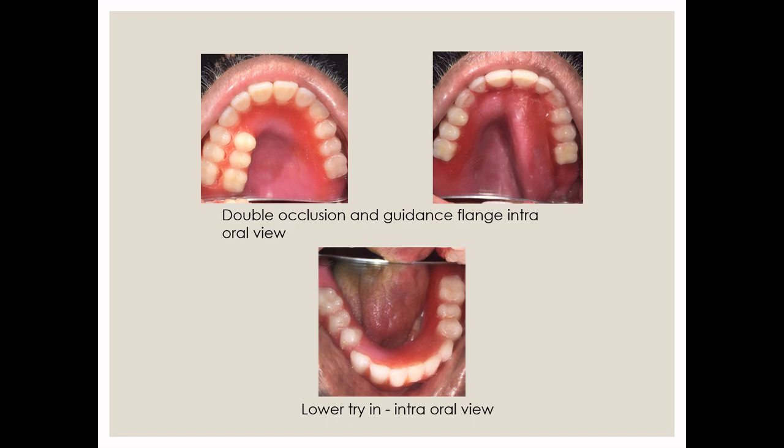And here semi-anatomic teeth were used and occlusal grinding was done to provide freedom in lateral movements. And here the teeth slide over one another down the incline formed by the second row of teeth and come into a functional occlusal position. And this teeth arrangement was verified during trial, and then the denture was completed as per the conventional technique.